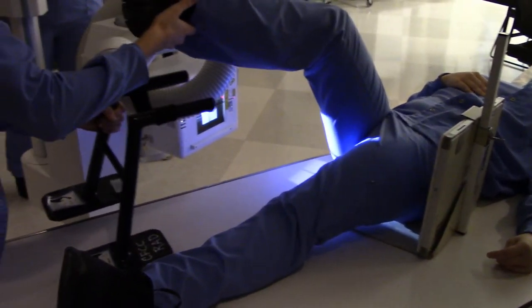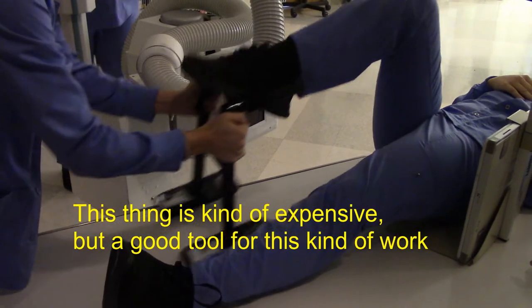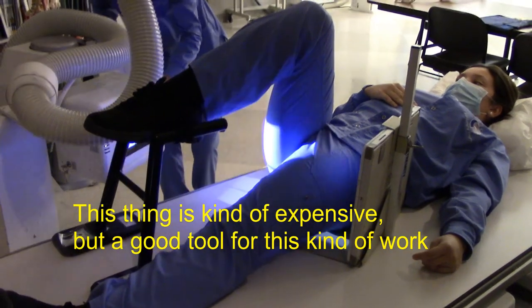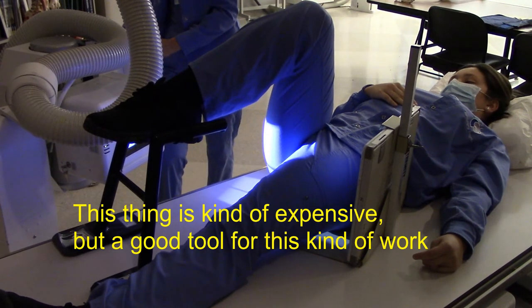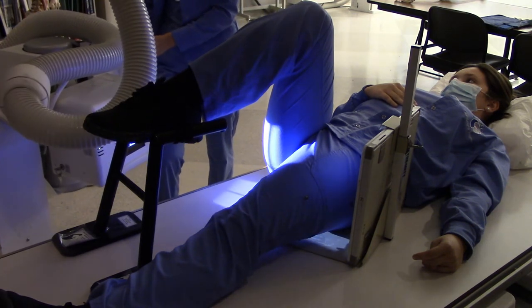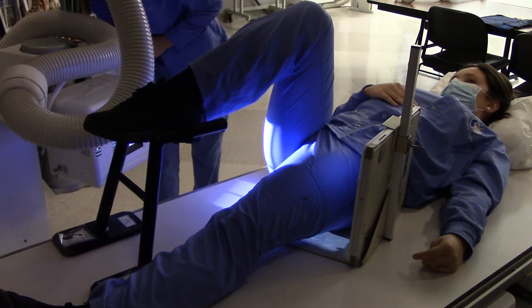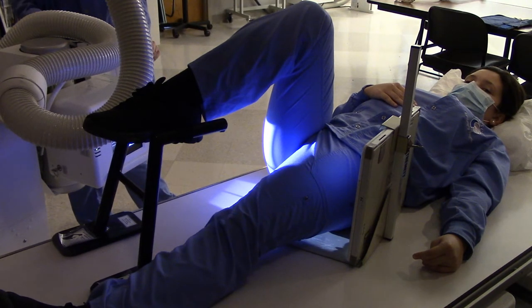Alright, we have a very handy device here. So the unaffected leg is up and out of the way. Now, did Ms. Berger emphasize with y'all about putting the image receptor parallel to the femoral neck?